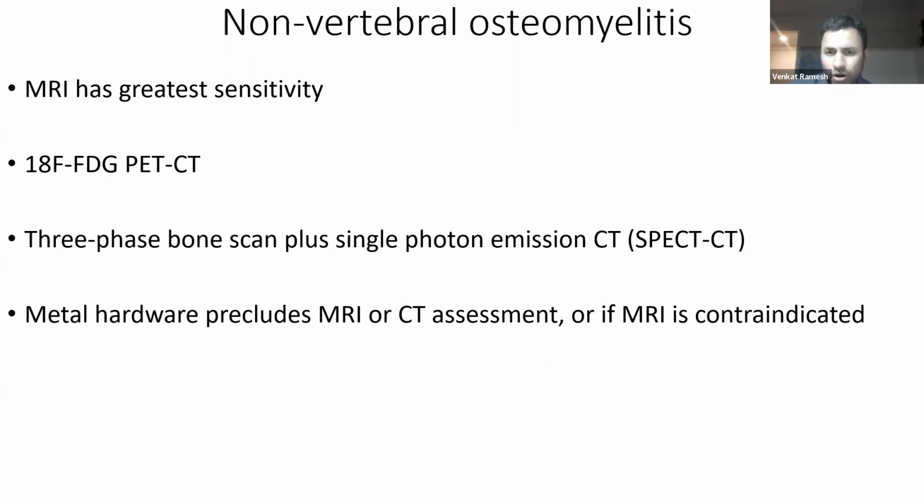So it's not often that a bone scan or nuclear medicine imaging is ordered for osteomyelitis. Really, for non-vertebral osteomyelitis, MRI still has greater sensitivity. So what often happens is that the nuclear medicine imaging has already been ordered, and then we are asked to consult for diagnosis, treatment, monitoring and so on.